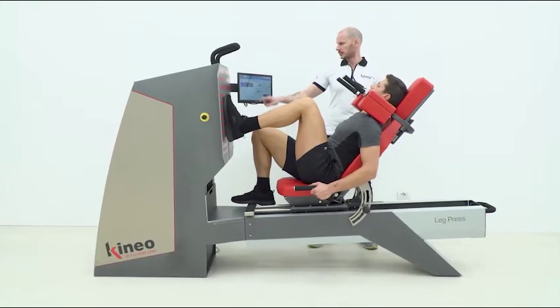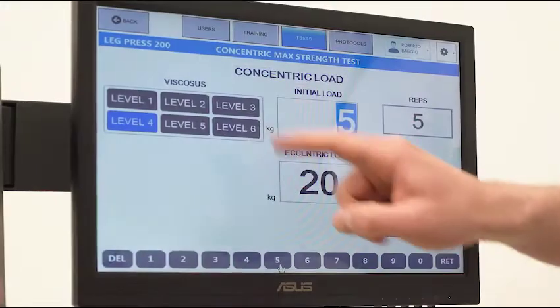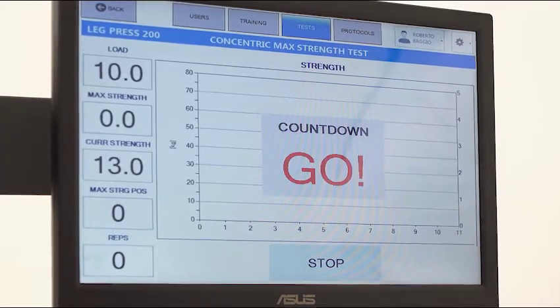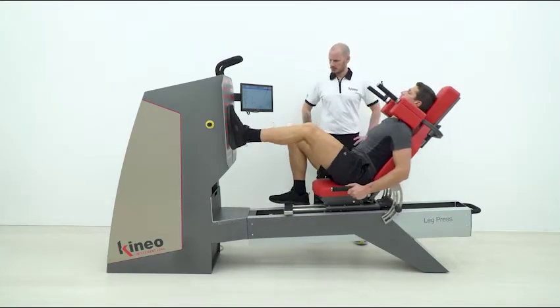Let's make an example with the leg press. We select a starting load of 10 kg and a level 3 of viscosity. We ask the subject to make a movement at 3 increasing speeds: slow, medium and fast.